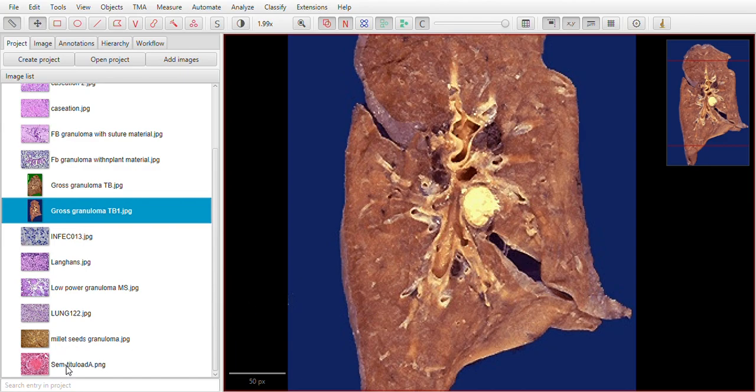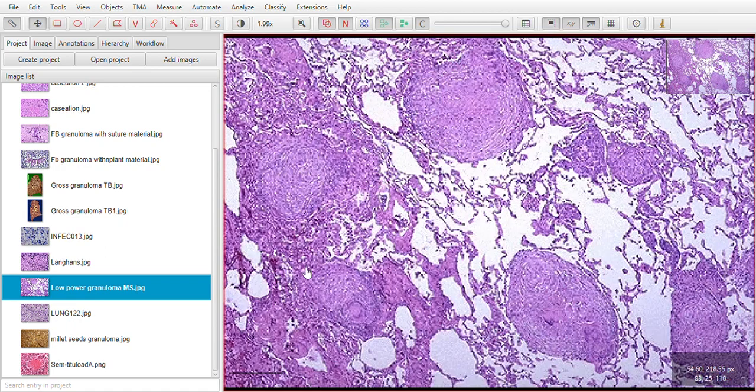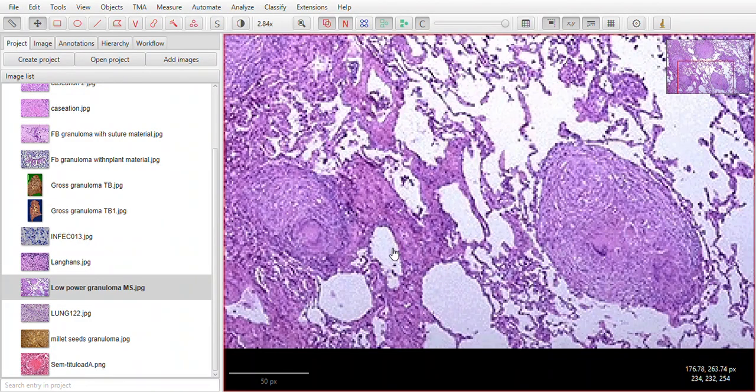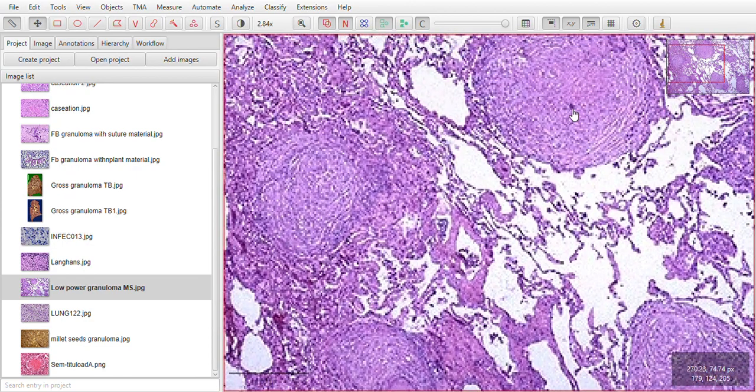Talking about the microscopic aspect of granuloma, when we go on low magnification of a tissue slide of lung parenchyma, the whitish background is lung parenchyma with all the air spaces. But in air spaces, you don't normally expect solidified areas. Here you can see solidified, very well circumscribed areas, maybe six here. When you go for a closer look, you can also see certain giant cells present over here. Another giant cell. Another giant cell.